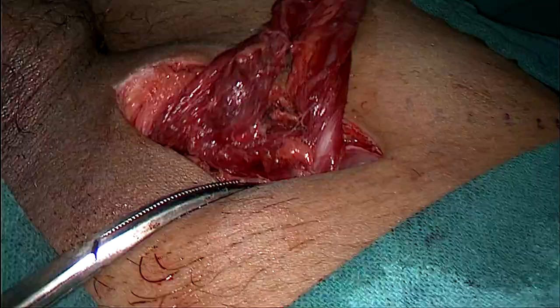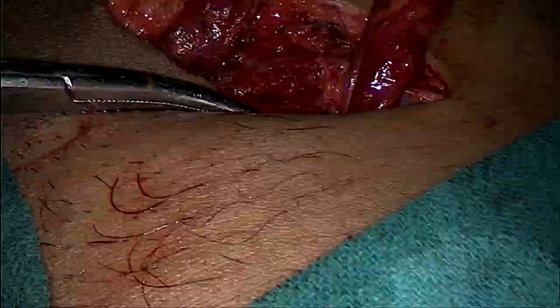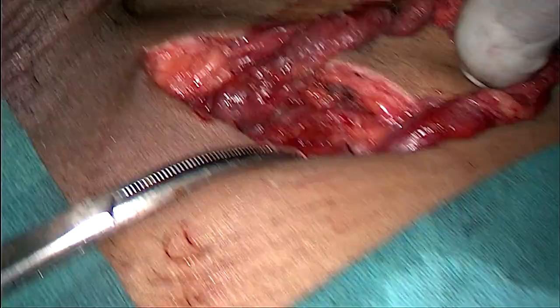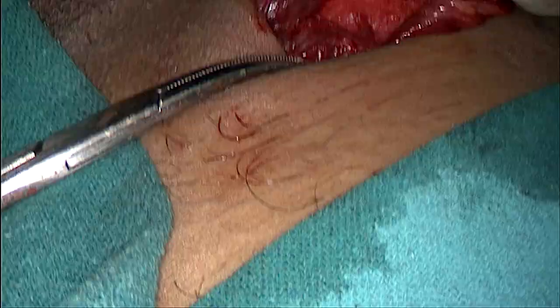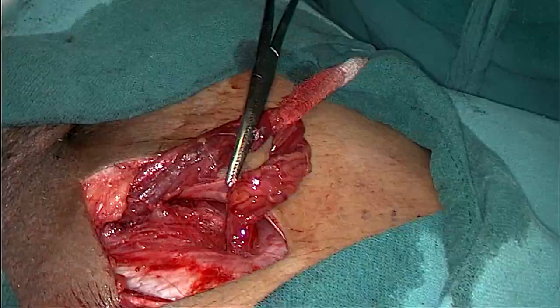As you can see, there is the edge of the external oblique aponeurosis, these are the cord structures, and now it's time to start repairing the posterior wall. Now we are lateralizing the cord to the right or lateral side, and at the same time we hold the external oblique aponeurosis with the artery forcep. There is the edge of the external oblique aponeurosis; my cord is on the right or lateral side, and this is the conjoint tendon.